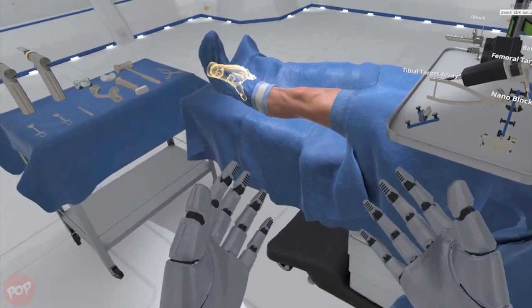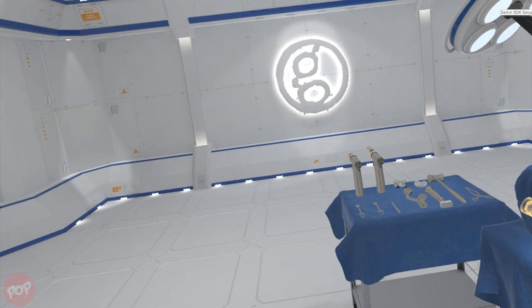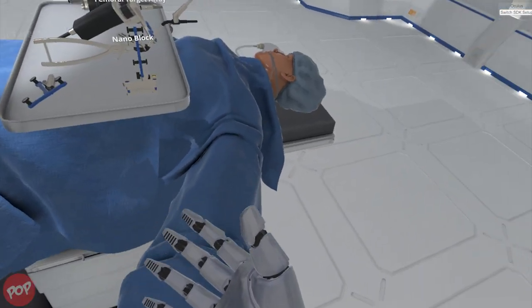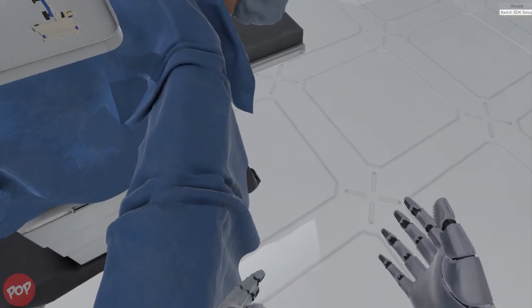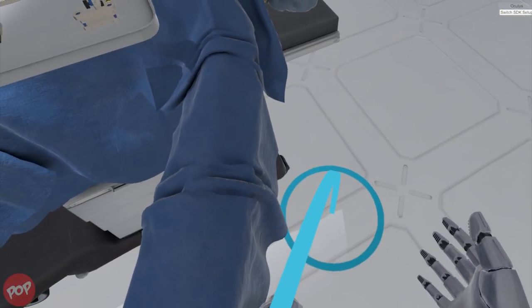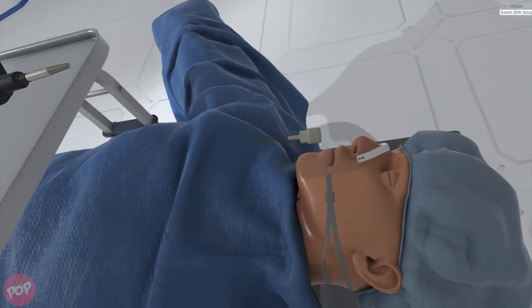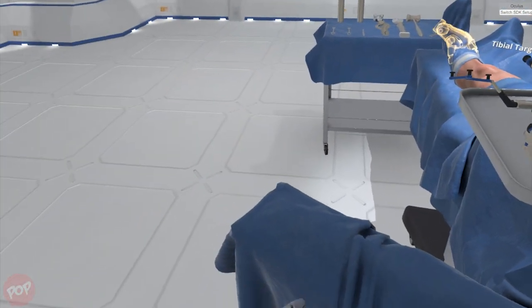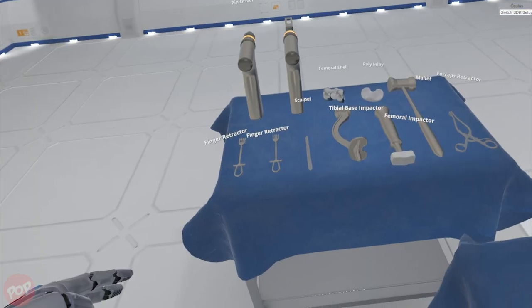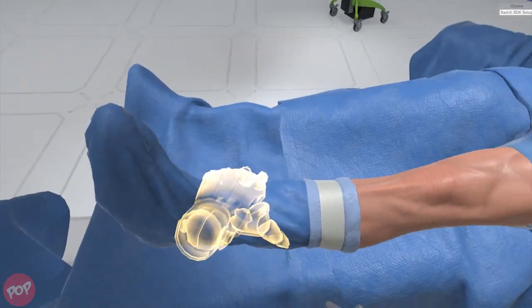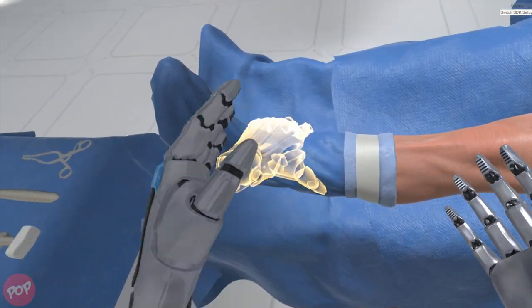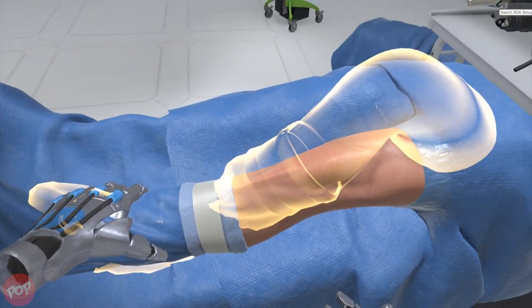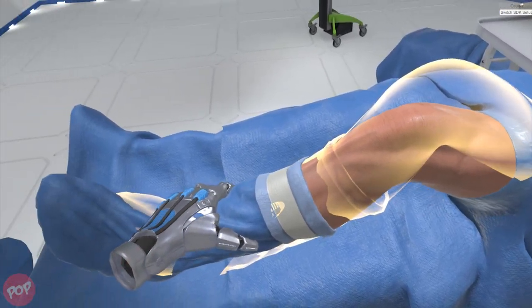Grasp the patient's left ankle, preferably with your left hand. Now manipulate the leg to reposition the knee into 90 degrees of flexion.